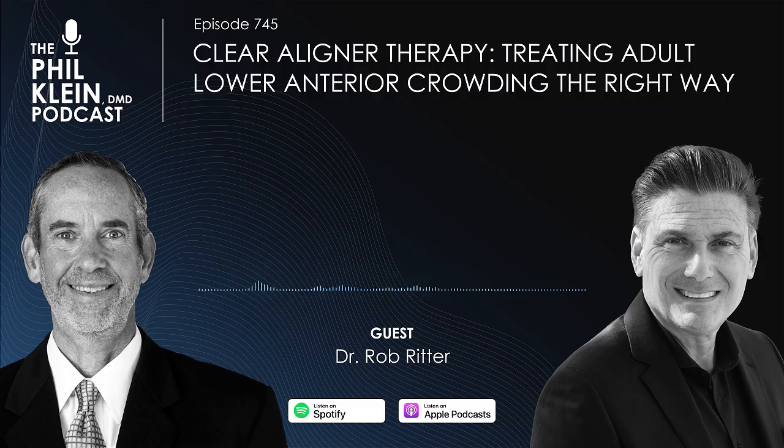If you do the Invisalign first, that means I have to be less aggressive. I have to take less tooth off. If I have to take less tooth off, that means the restoration is going to last longer. It's that simple. You don't do this. Can I do this with just restorative material? Absolutely. I have to be more aggressive and take more tooth.